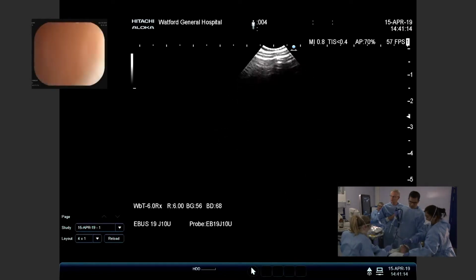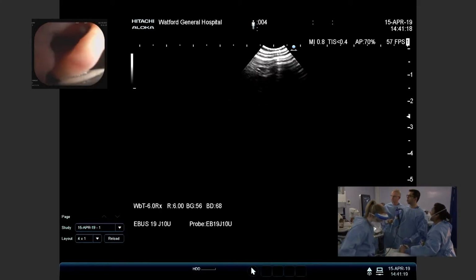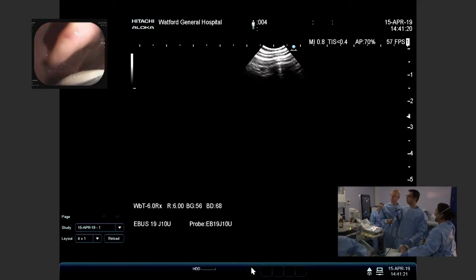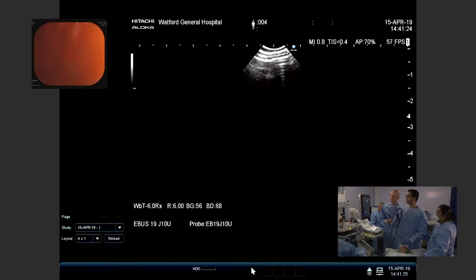Okay, dear. We're just putting some local anesthetic that is making you cough because we're trying to numb your vocal cords, and that's quite natural. Takes about a minute or two, and then it will settle down.